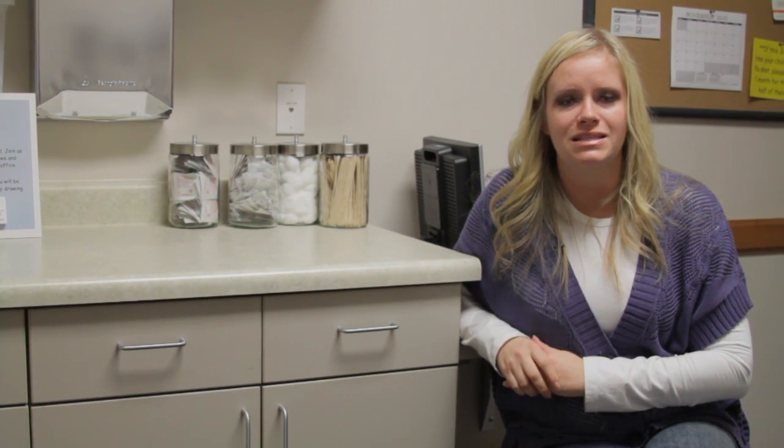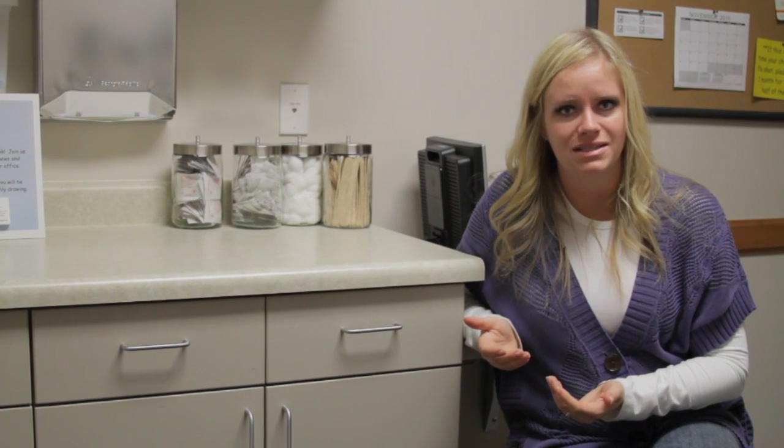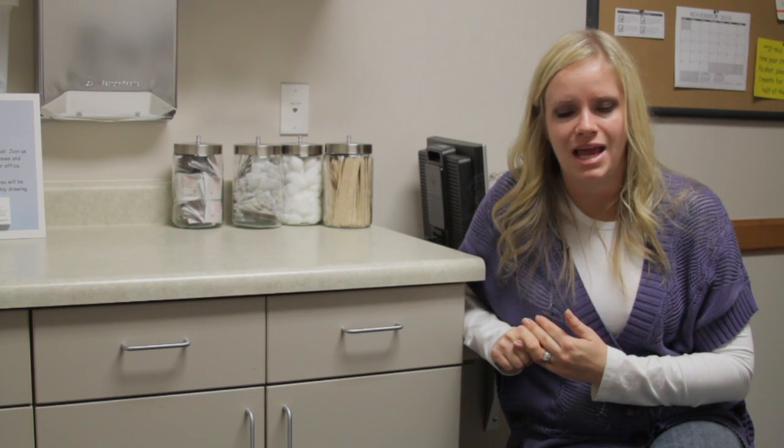Today we're talking about how to check your IUD strings. An IUD is an intrauterine device that women often use for prevention of pregnancy. There's a Mirena IUD that can last up to 5 years. There's a Paragard IUD that can last up to 10 years.